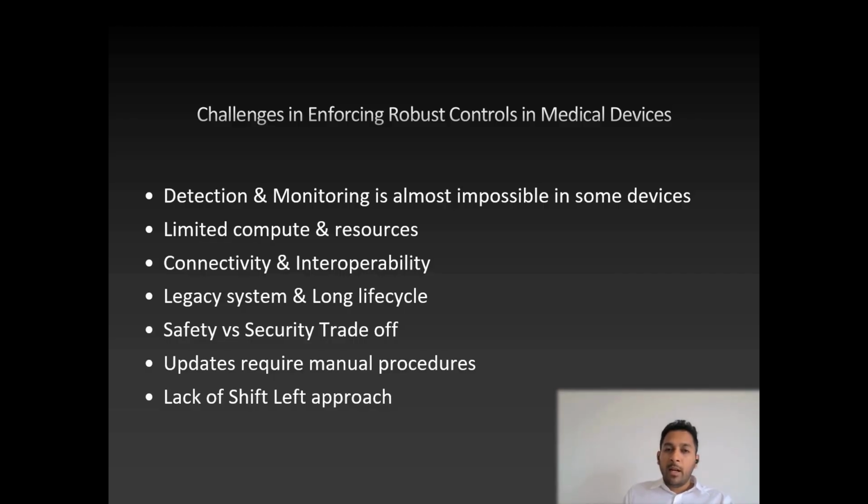And again, the safety versus security trade-off. You need to prioritize safety over security, because it's a patient's life and it has a huge impact, rather than security. Some devices, because of lack of connectivity or lack of remote update capability, need to be updated manually. So it creates a delay in issuing security patches.